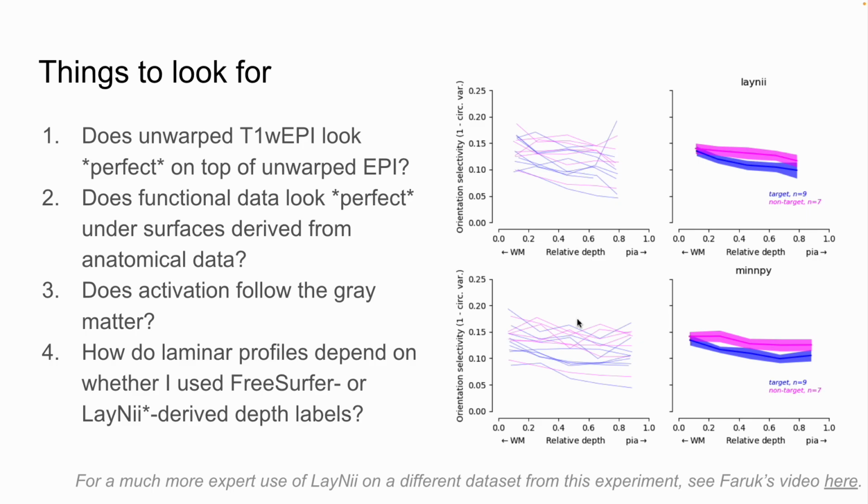So we did a scrambled control, and sure enough, just the noise scrambled control looks just like our data, where there's a slight peak in the deepest layers and then it comes down. And this is because the F statistics in our data are lower in the deeper layers, because the T2 star weighted functional MRI signal is a bit weaker in deeper layers for reasons that we're all still a little bit not sure about. But they are, and I don't like the most probable answer.